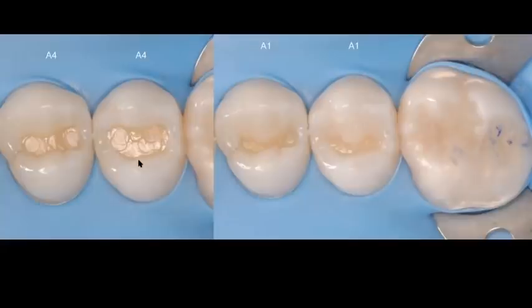In this particular case, because my preparation wasn't very deep, I knew that I only needed one horizontal layer. Keep in mind that when you're using regular microhybrid composites or nanohybrid composites, you want your layer thickness to be 2 millimeters or less. So you can use a probe to measure, or you can use your eyes to visually estimate how deep this preparation is. But try to stay in that range of no more than 2 millimeters for your increments. Now, what you're seeing here is that I am applying, and sharing with you, the shade that I'm using. I would say 8 out of 10 times, I'm going to use an A4 dentin, a very saturated dentin shade for my first horizontal layer.